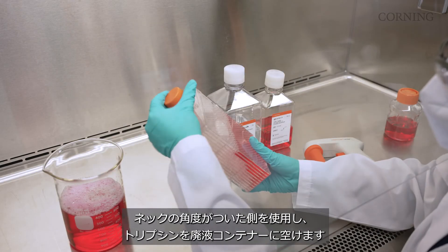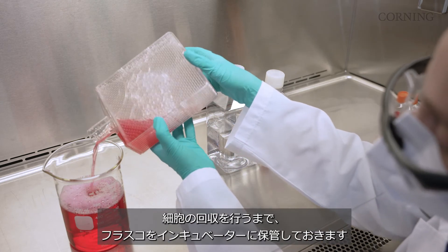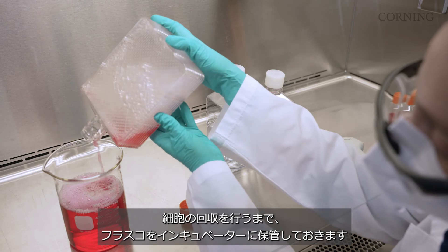Again, pour off the trypsin into a waste container using the canted side of the neck. Once emptied, you can then incubate the flask until you're ready to harvest.